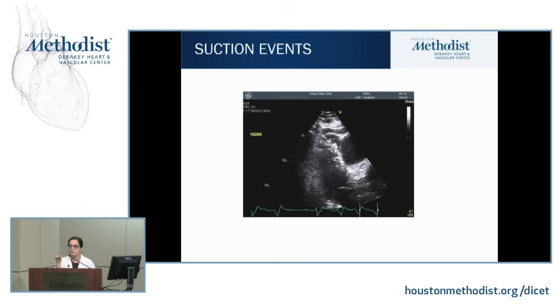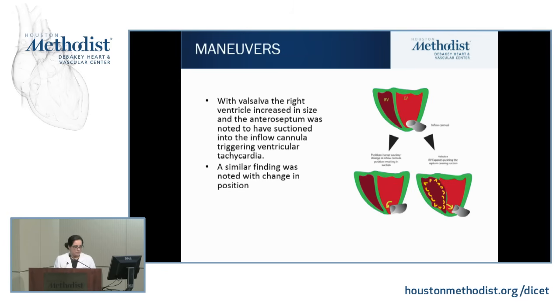So we ramped his speed down. And interestingly enough, he was also having rising LDH, because when you're creating a lot of suction, like let's say if every second or third beat you're having suction, you're creating an area of thrombogenicity. So his LDH also came down after we decreased his speed. Now, he was in clinical heart failure, so that's the imbalance there. We had to just put him on more diuretics.